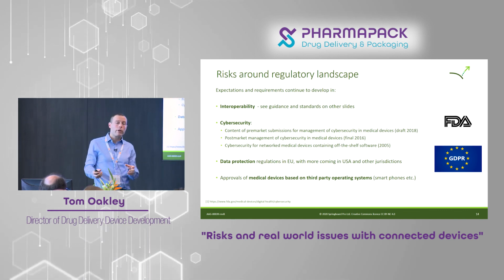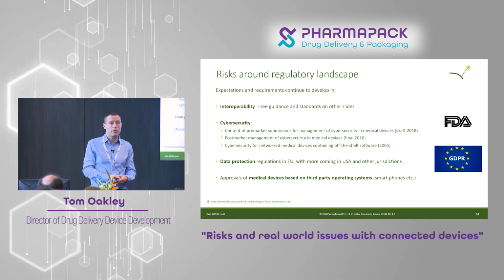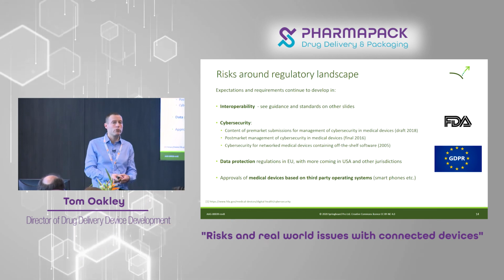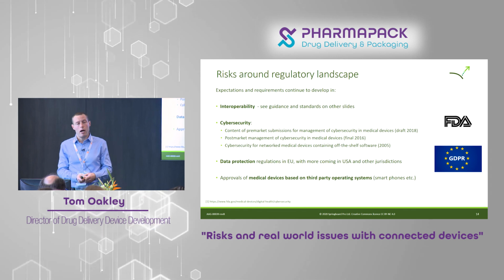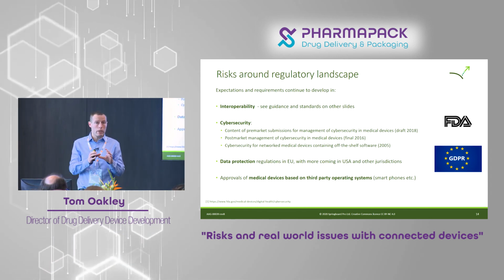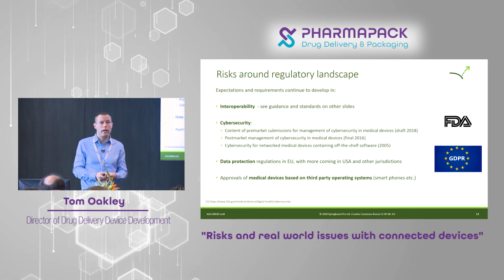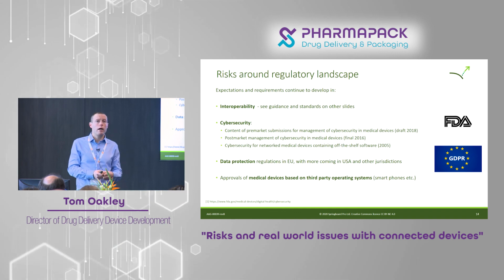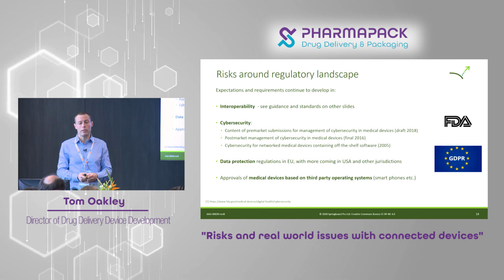We're seeing another aspect of connected devices being regulated, which is data protection. So perhaps the biggest example would be in the European Union, the General Data Protection Regulation, for which the UK is still subject to. And you're seeing that across other jurisdictions now as well. So in the USA, they're doing it more on a state level, California perhaps being the most advanced in this process. But data protection is an increasing bar to meet, and probably rightly so.